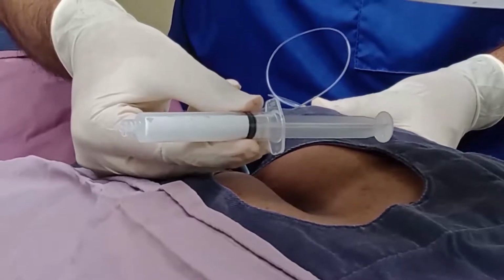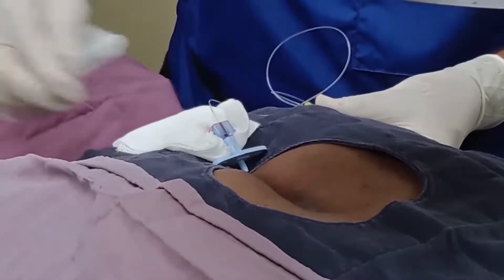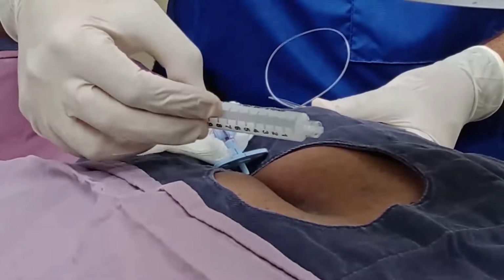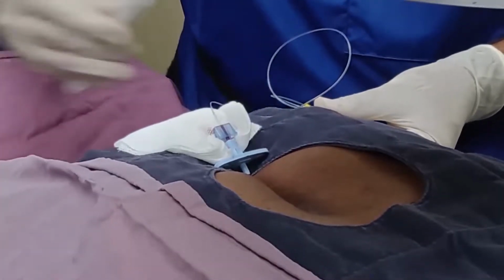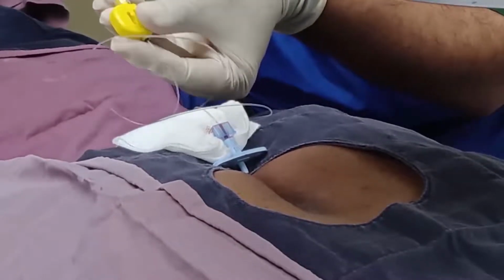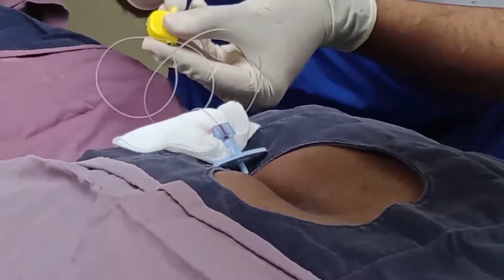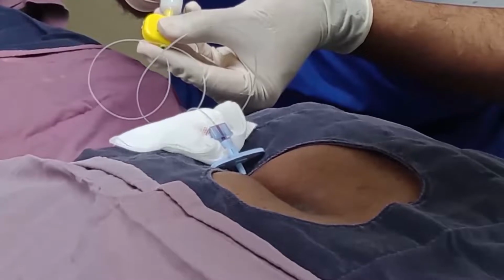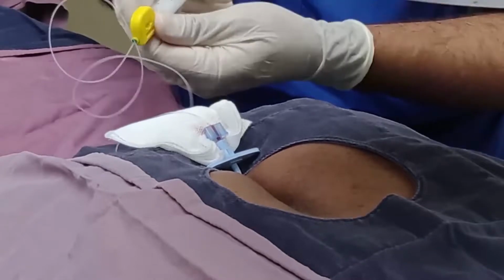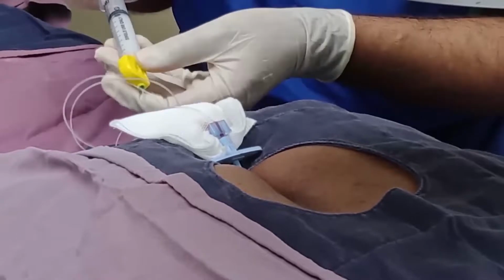The 80 milligrams of triamcinolone in normal saline is again shaken so that the particles are equally distributed and are not lying lower down in the syringe. After the satisfactory confirmation of the contrast, triamcinolone 80 milligrams in normal saline, after negative aspiration, is being injected slowly. After every couple of minutes, it is aspirated to ensure that there is no blood or CSF coming back.